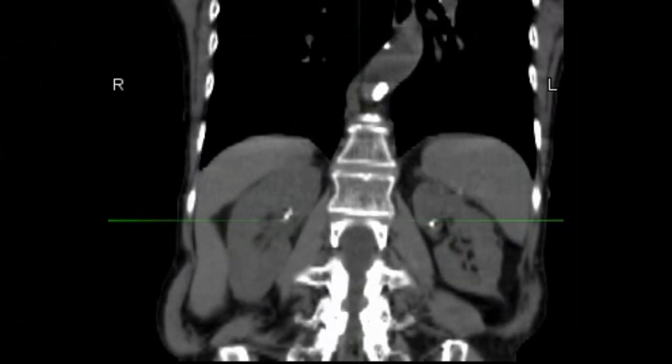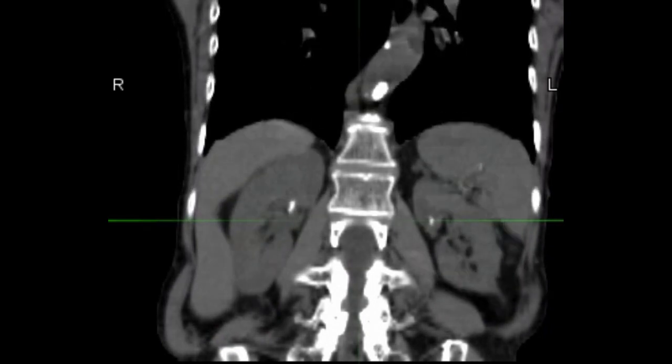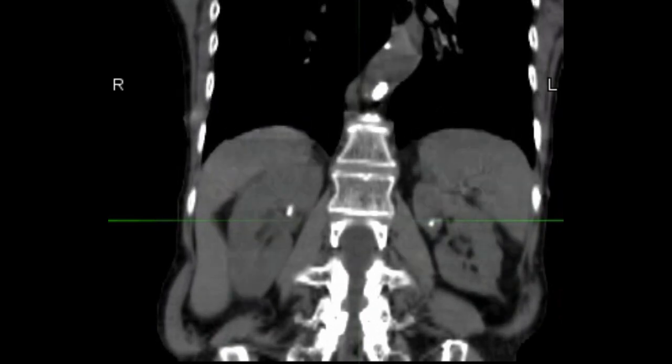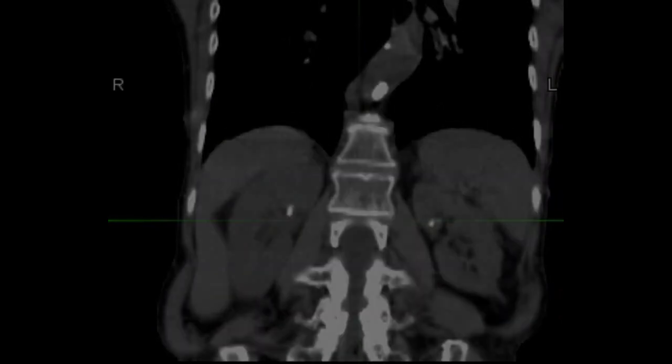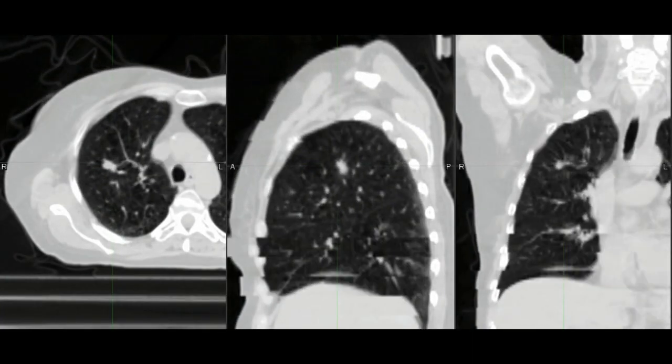This technology can be applied beyond the lung. People quickly realized that the abdominal contents move a lot too. And here's an example of the kidneys moving around with respiration, the liver, everything in the abdominal cavity, even down into the pelvis, really. Now let me freeze this movie for a minute and talk about something.